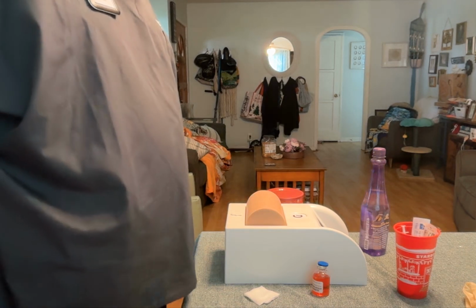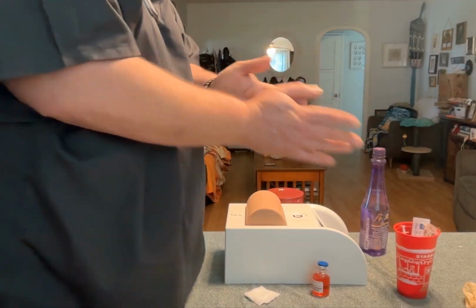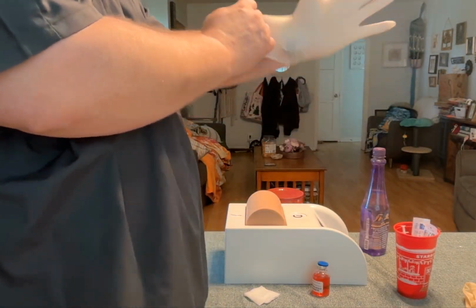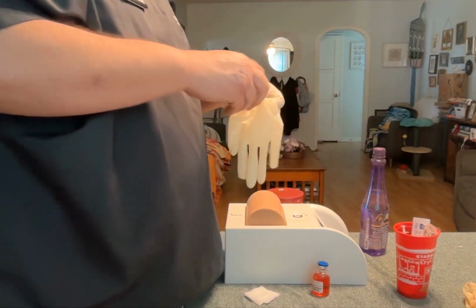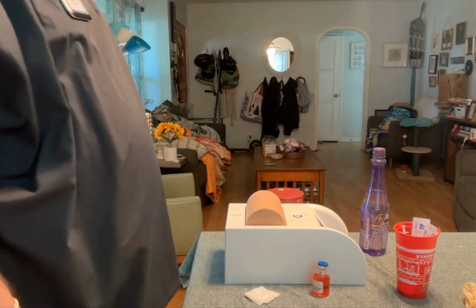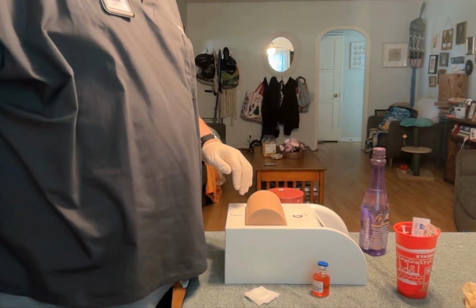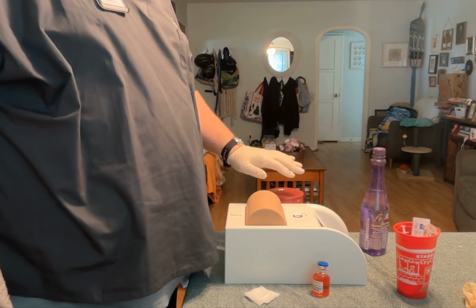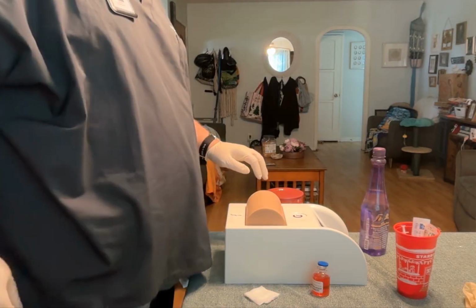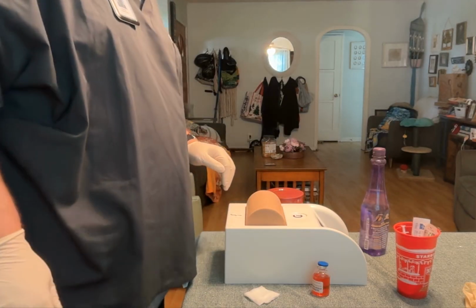I'm going to provide hand hygiene, and perform hand hygiene, and I'm going to put on gloves. I'm going to ask the patient their full name and date of birth, and I'm going to compare what they tell me to their wristband, as well as my MAR. So I have 3 checks, and their name and date of birth matches up. Everything is as it should be.